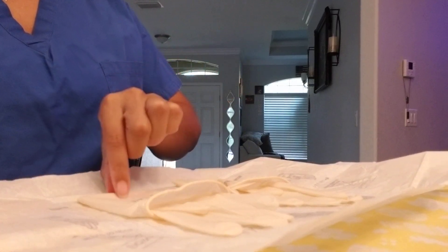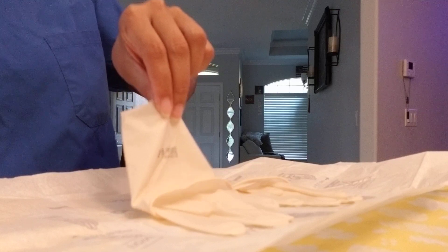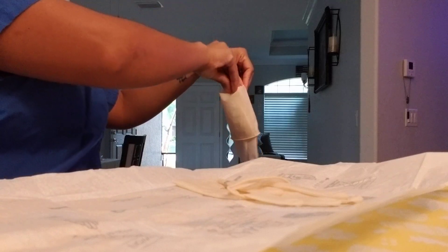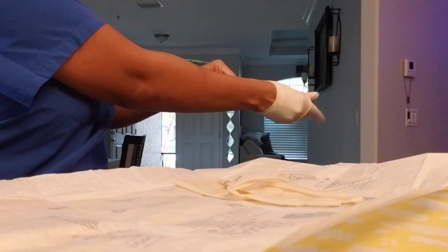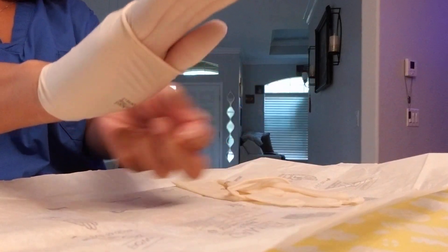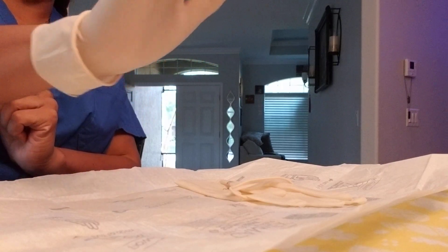I'm right-handed so I'm going to put my right glove on first. I take my left hand, grab the very edge of the cuff, get my finger in it nicely. Pick it up, go away from my field — pterodactyl — go in, turn my hand up so it matches the glove, and pull my glove on. Now I have a little cuff — I grab right here, not up higher, because all of this is sterile.